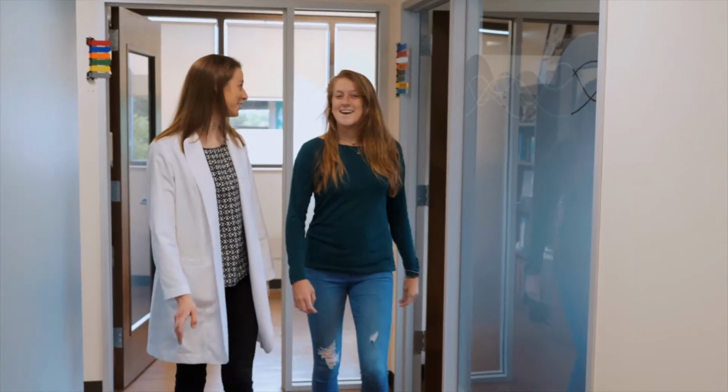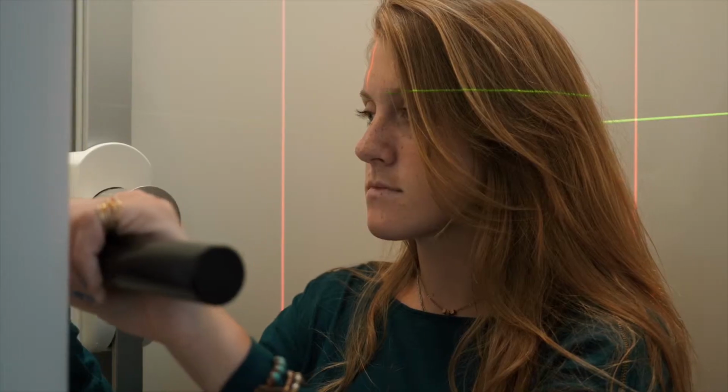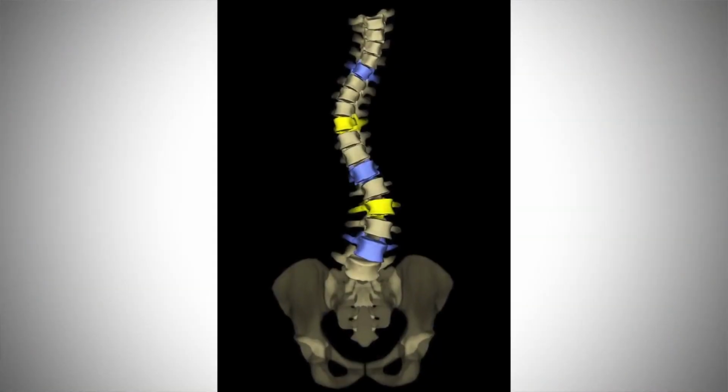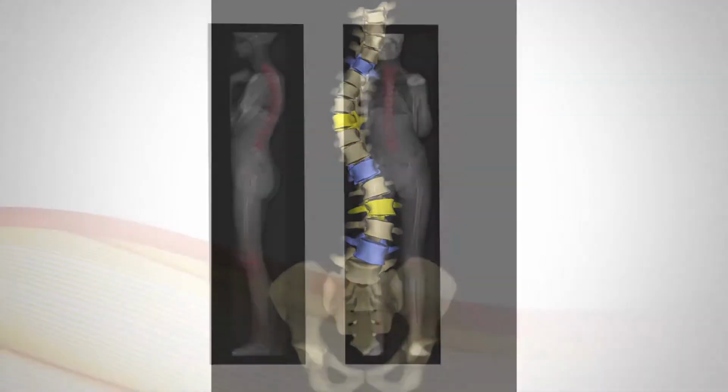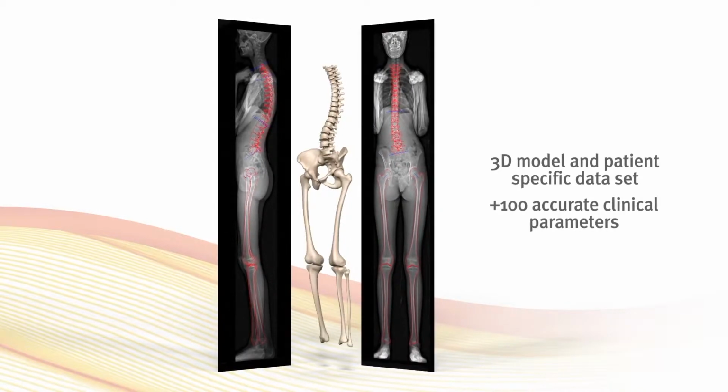The complete offering from EOS Imaging provides differentiating technology that can improve patient care. University Orthopedics made the decision to buy EOS because this is just a crucial part of our ability to care for patients. In the world of pediatric orthopedics, we've known about EOS for a long time, and it's been revolutionary in the way we've evaluated spinal deformity and the effects of our treatment.